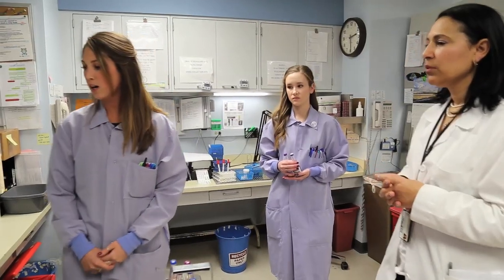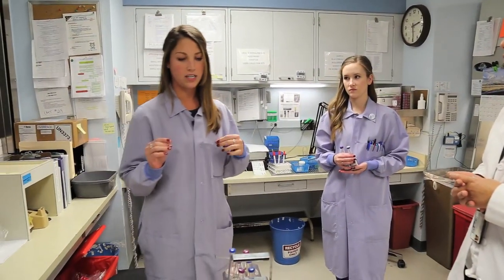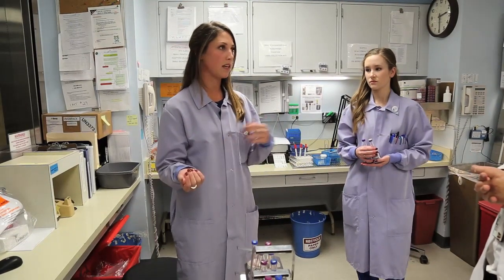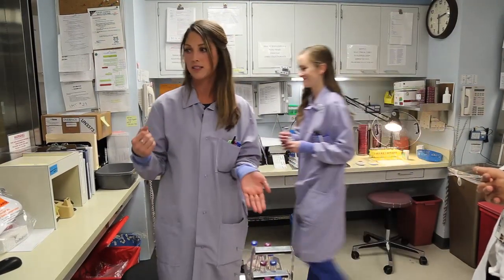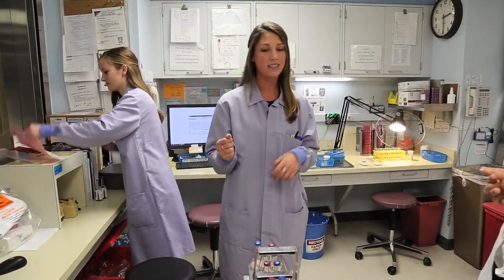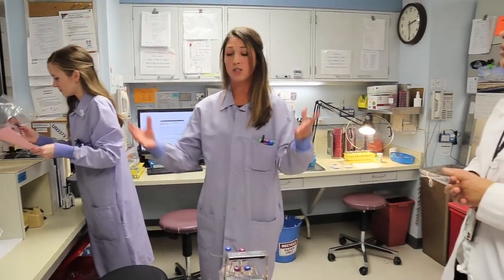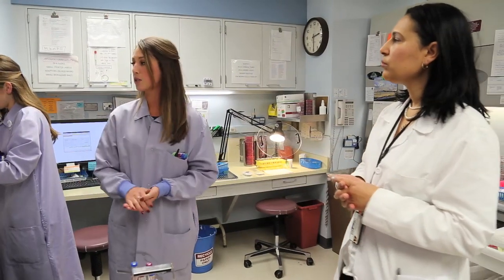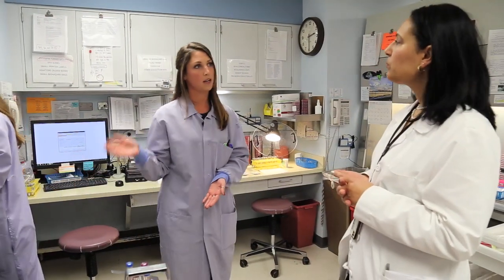Okay. And then where do you go from there? From there, we decide what takes priority, and so that would be stat specimens. Mainly those are ER specimens, and we can separate those from the rest because they are in red stat bags. So we pull those first. We usually get buckets at a time depending on the time of day. So we'll pull those, we'll run those, as well as any spinal fluids we might get that come through the window. Those take priority over everything. So we'll get those set up right away.